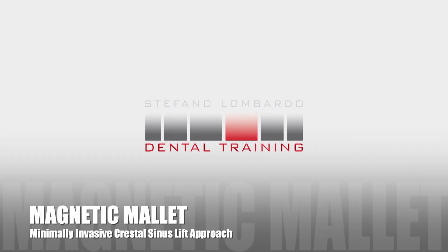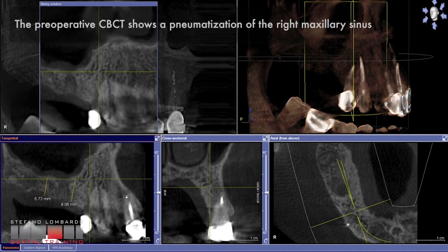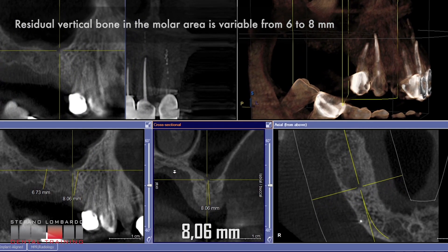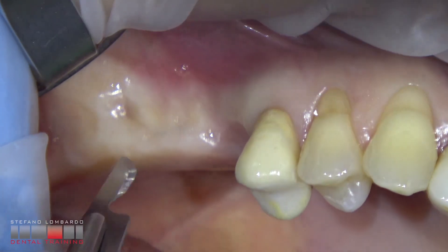New technique for minimally invasive crestal sinus lift with magnetic mallet. The preoperative CBCT shows a pneumatization of the right maxillary sinus. The residual vertical bone in the molar area is variable from 6 to 8 mm.